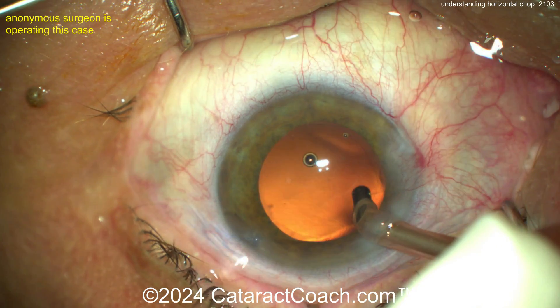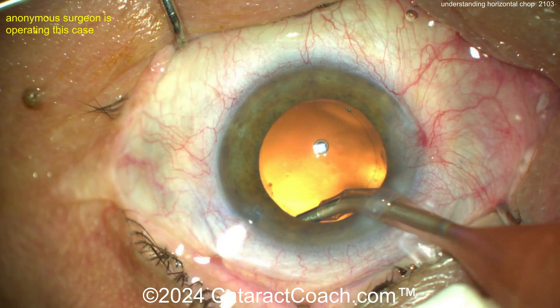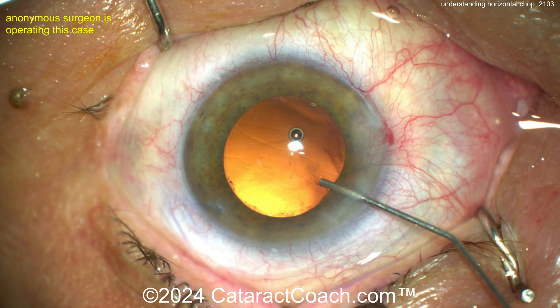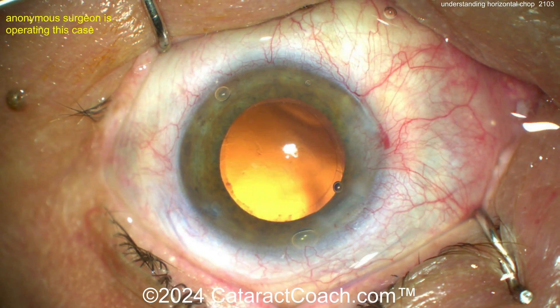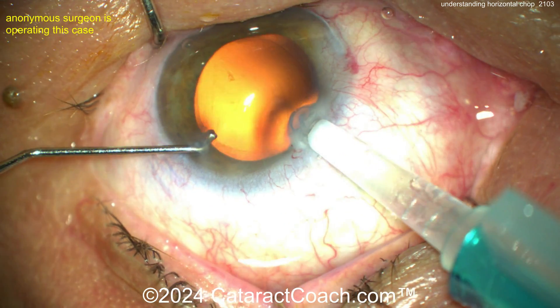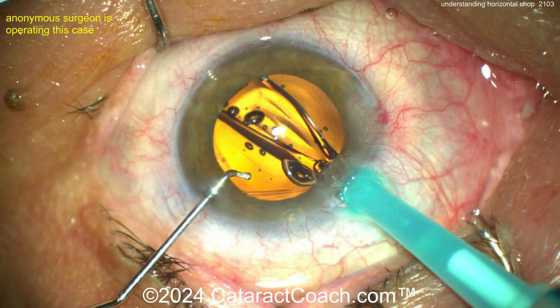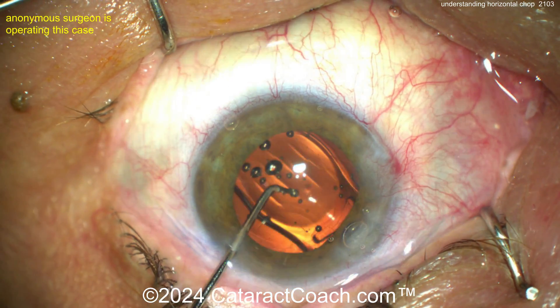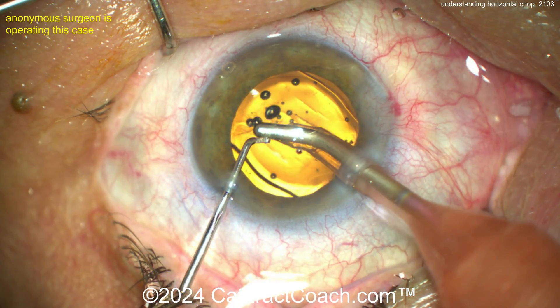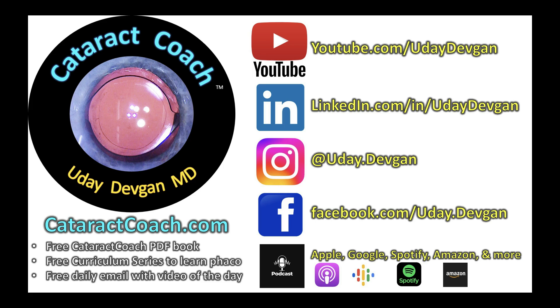What are appropriate settings? When you buzz in with the phaco probe you need some energy — for a denser nucleus, at least 50% energy. The key is holding power, so you need high vacuum. For most phaco tips, you're looking for vacuum levels of at minimum 300 mmHg, even up to 400 or 500 mmHg. Maintain that vacuum level during quadrant removal and sub-chops, and keep the aspiration flow rate relatively high — at least 35 cc per minute — so things happen nicely inside the eye.